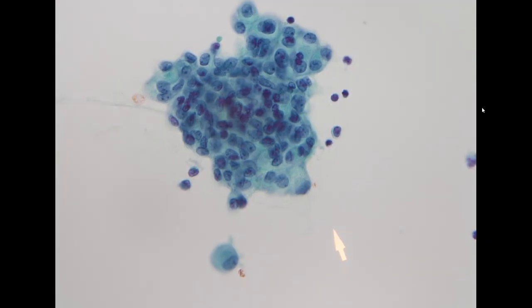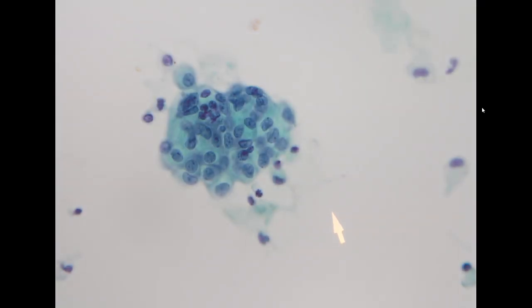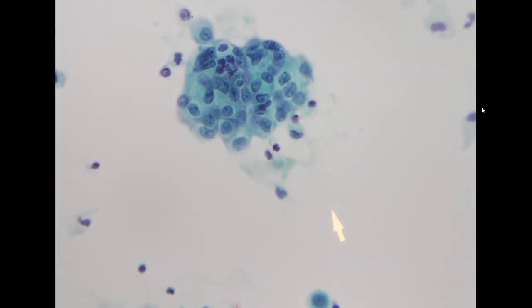When you check the clinical information, the patient does have cirrhosis. The HCC is related to the cirrhosis, and she is currently in Child B to Child C status. If the patient has liver cirrhosis, usually the liver surface would be very irregular. Through your breathing and body movement, the irregular surface can induce reactive changes of the mesothelial lining in the peritoneum or in the visceral.